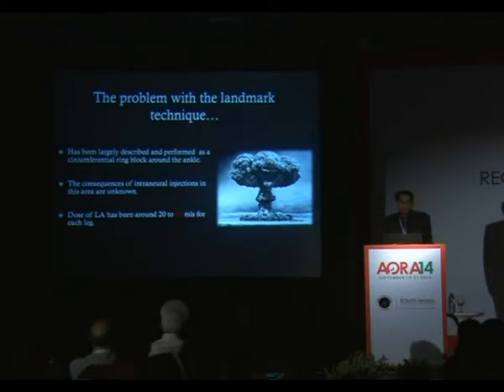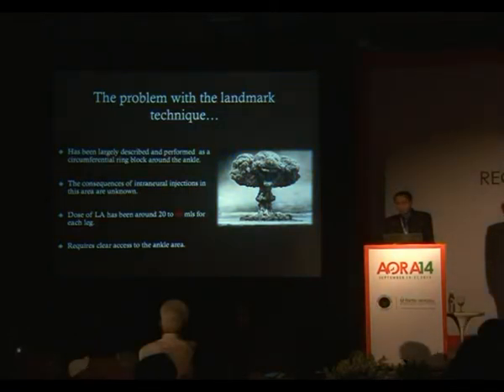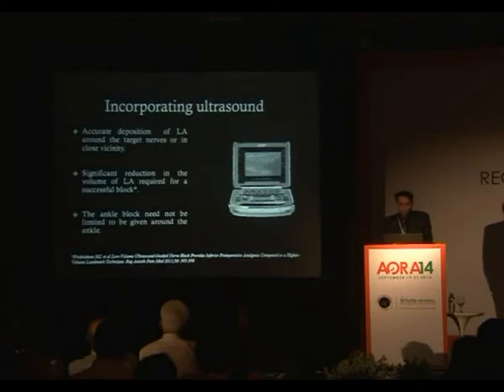It's a little bit ridiculous to be giving 40 ml for the nerves, and I'll show you why. Most of the patients who are going to get an ankle block are going to have an edematous or a cellulitic ankle, so you don't always have clear access to the ankle. So when you use ultrasound, let's see what ultrasound can actually do to help us give this block.